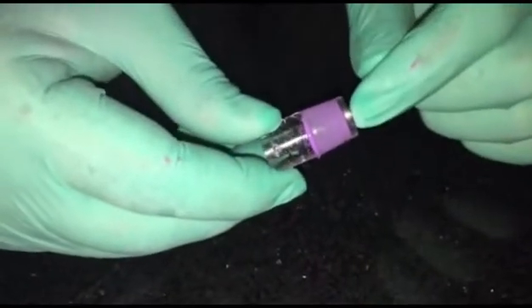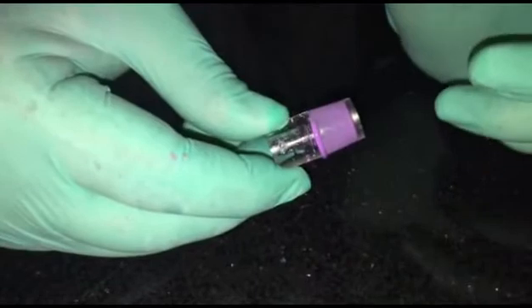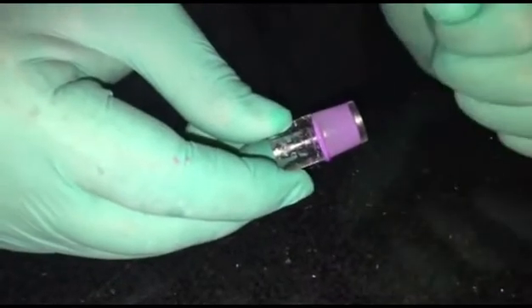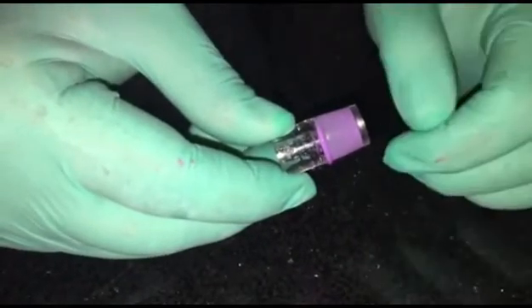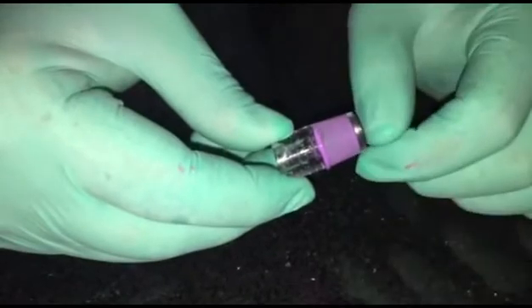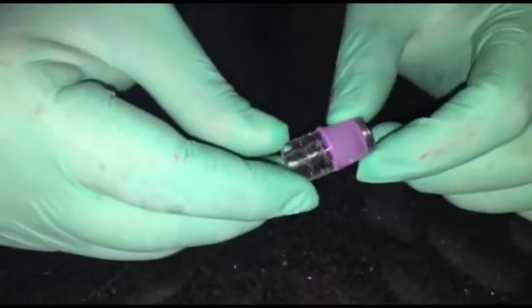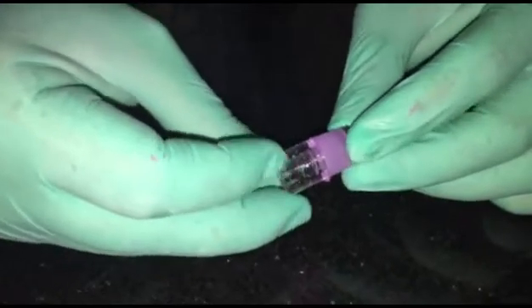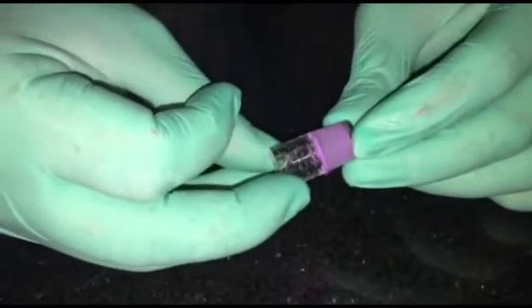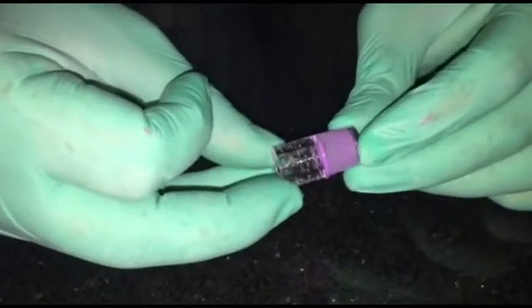Just a little, and provided your prosthesis has been properly made, see how beautifully the GIC or any other luting cement will flow and will hold the crown in place. Thank you.